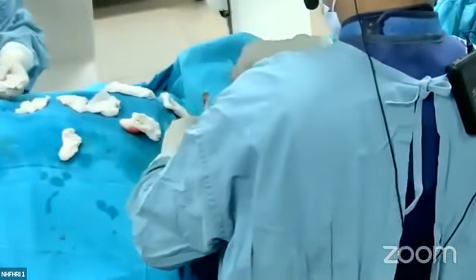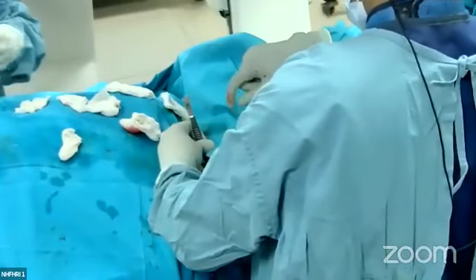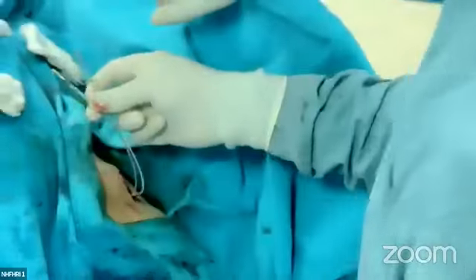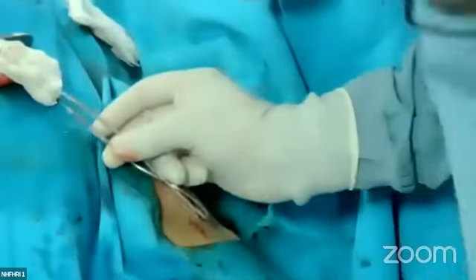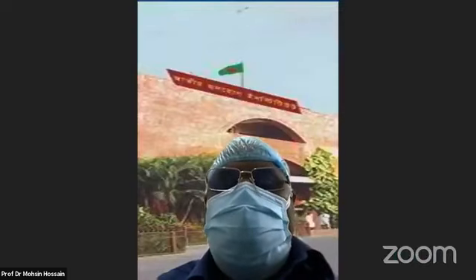I think on the left side of the patient, lead fixation and lead stability is better. Sometimes there is an obligatory indication: if the lead was previously done on the right side, you have to do the lead in the left side. Next question: if there is infection in the left side, we are taking the generator, you have to go to the right side.